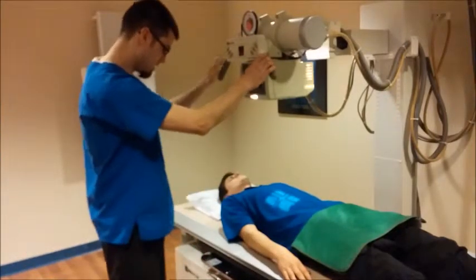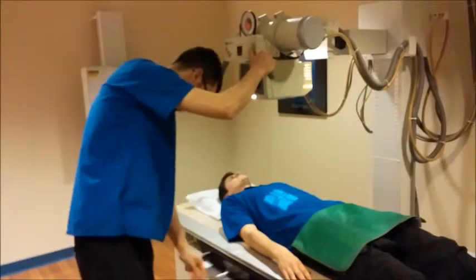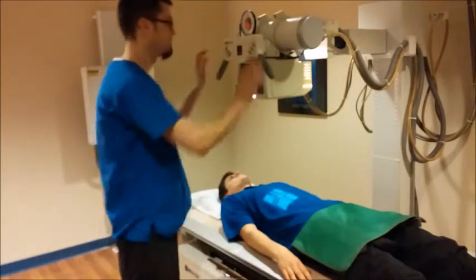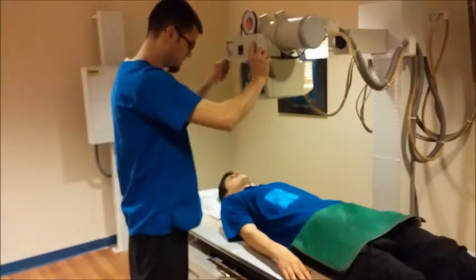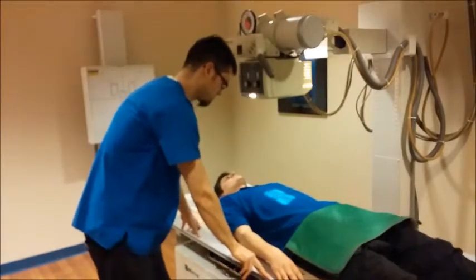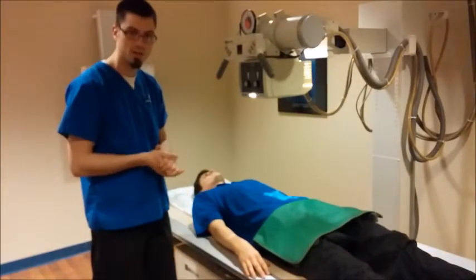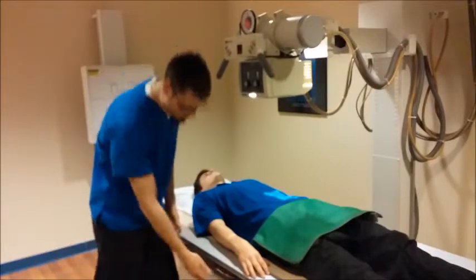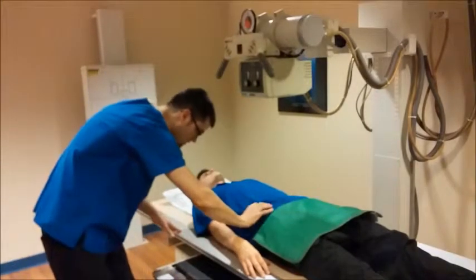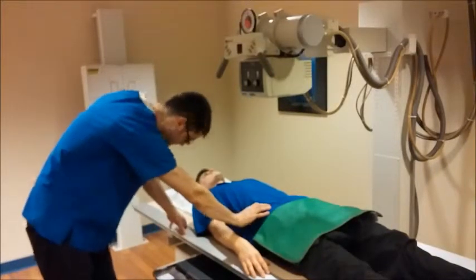And we will align the tube to the bucky. Right, and it's also in transverse detent. And for positioning, it's the same as the erect. We want to put the bottom of the cassette right at the top of the iliac crest, so we would find those. Find the ASIS, go up, find the crest.